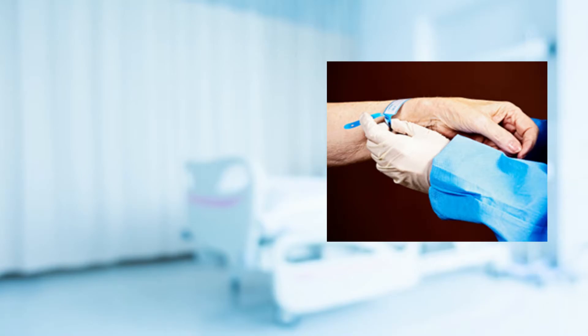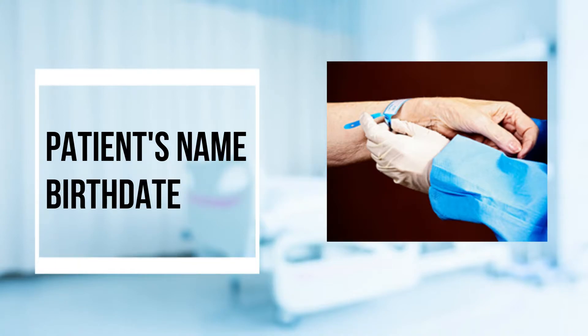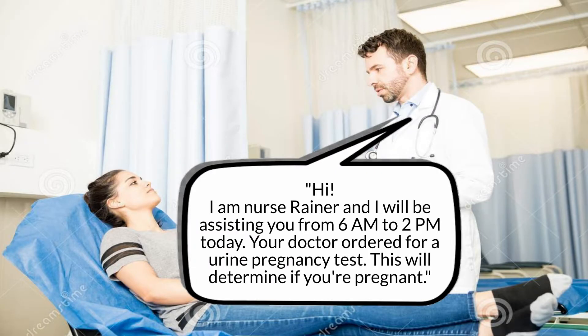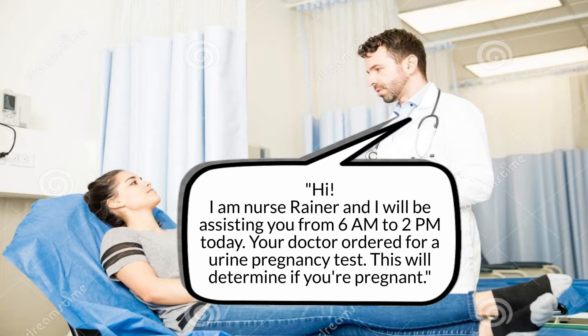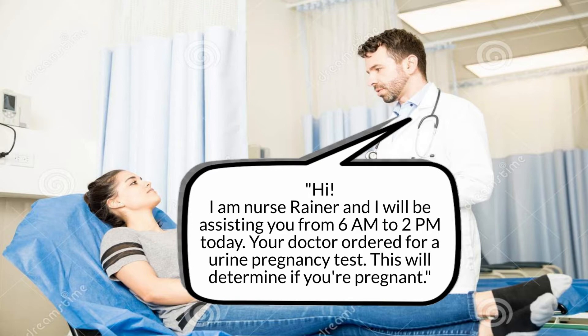Step 1: Identify the correct patient by using the two patient identifiers, asking the patient's name and birth date. Next, introduce yourself and explain the purpose of the intervention by saying: 'Hi, I'm Nurse Rainer and I will be assisting you from 6am to 2pm today. Your doctor ordered a urine pregnancy test. This will determine if you're pregnant.'